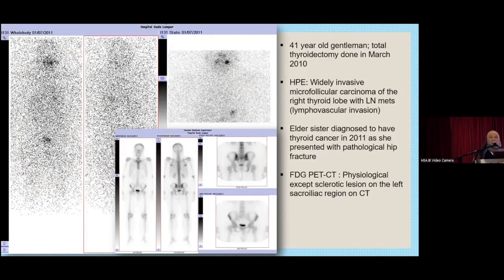Okay. So basically, among the MOH hospitals, HKL was the first hospital to have SPECT-CT. It was in 2014. So since I am going to share my experience about using SPECT-CT in managing DTC patients, I would like to show what happened before we had our first SPECT-CT. We have our SPECT-CT in HKL somewhere in 2014, and there's one patient that really made us want to fight to have a SPECT-CT.